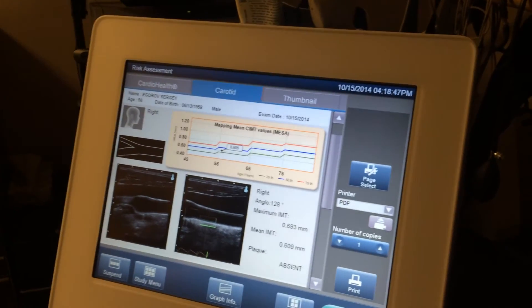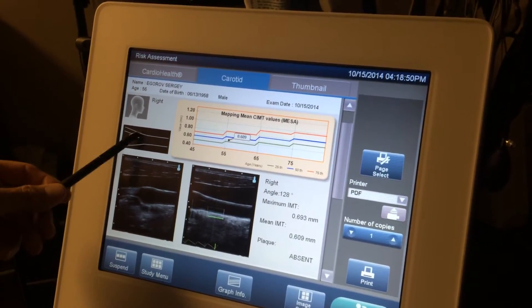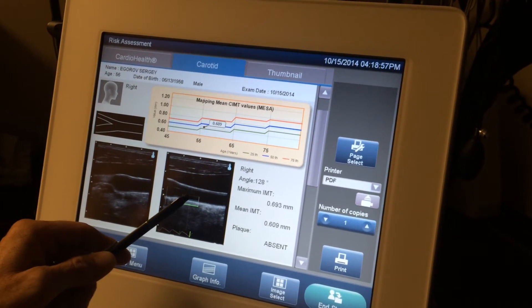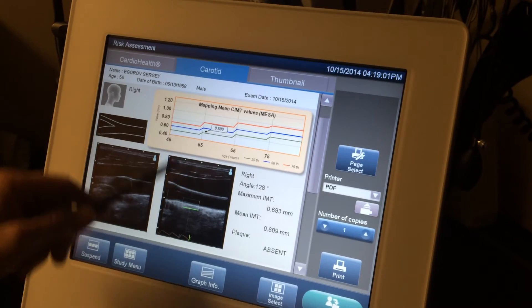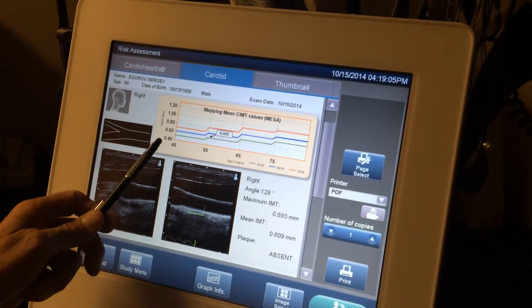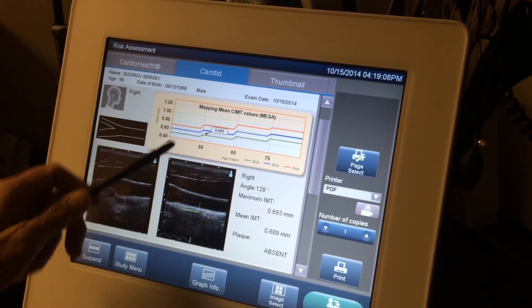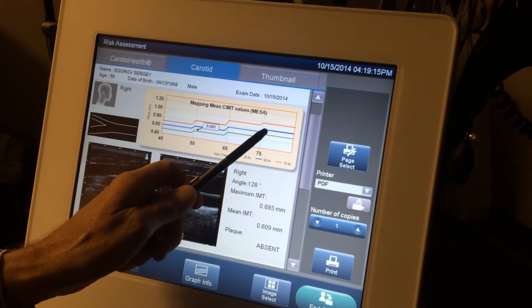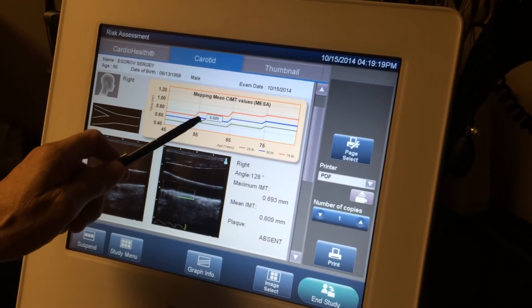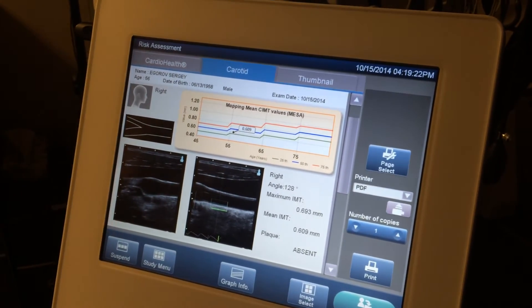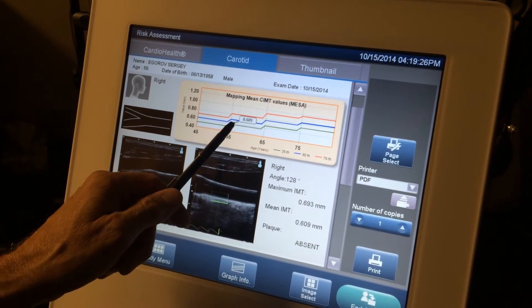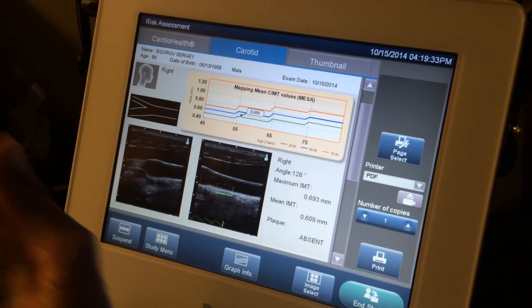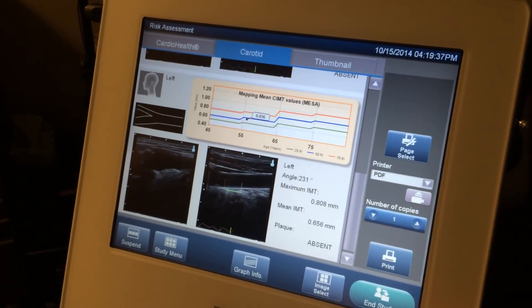So what we have here on the right — here's your bifurcation point, that's where the plaque usually shows up first. No evidence of any plaque. We move back a little bit further and check the wall thickness measurement. It was 0.609 millimeters. We then put it into a database of about 7,000 people with the age range and the thickness range. The blue line is the median thickness — this reflects how thickness goes up as we get older. If you're below that blue line, your artery is healthier, physiologically younger. You're down closer to the green line, which is the 25th percentile. So your artery wall has accumulated less cholesterol over the lifetime, basically.